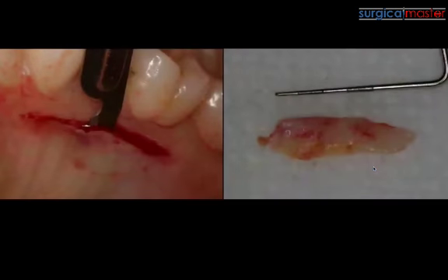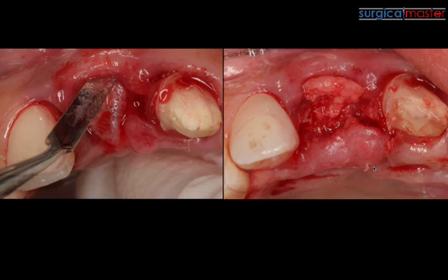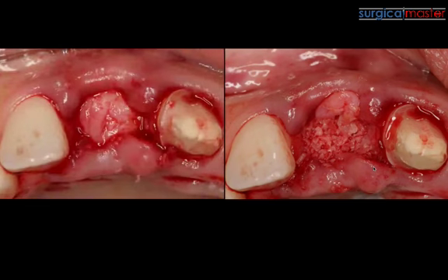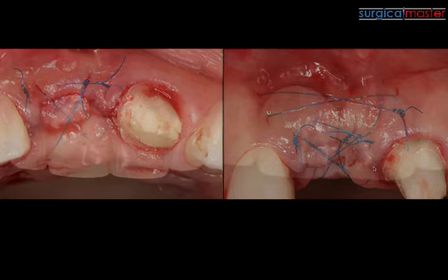And in this case, I added a connective tissue graft under the buccal flap at the time of bone grafting because I wanted to maximize the soft tissue profile. I used the compartment technique. Okay, I had the buccal plate. I just enhanced the soft tissue with a connective tissue graft, used my bone graft, and actually used the connective tissue as part of the compartment technique for the sealing of the socket, for the roof. And by using X sutures and an X suture on the buccal, that allowed me to retain my graft and get a pretty good implant site and very good healing.